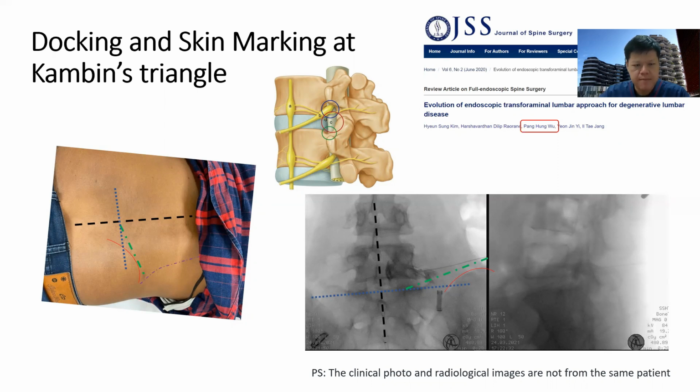We manually palpate the muscle margin. The incision should be medial to the lateral margin between the erector spinae and the soft tissues. On the lateral view, we look for the approach again to Kambin's triangle. We mark the posterior spinous process in patients who would like a paracentral disc approach, and we measure the distance from the midline.